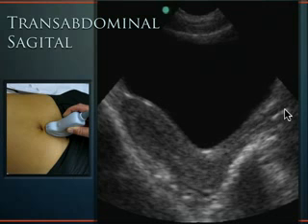That's actually the walls of the empty vagina all caved down on itself, and you get an echogenic line like that. Okay, so going from the outside world into the vaginal vault, you terminate at the cervix, and then you have this sort of 90 degrees where the uterus comes off that way. That's the anatomy there. It's a little confusing at first, but over time it makes sense.